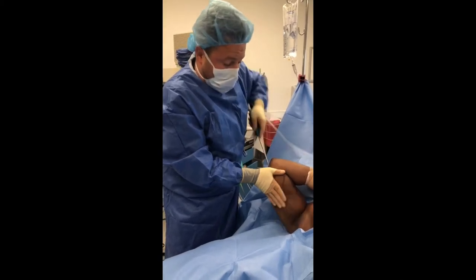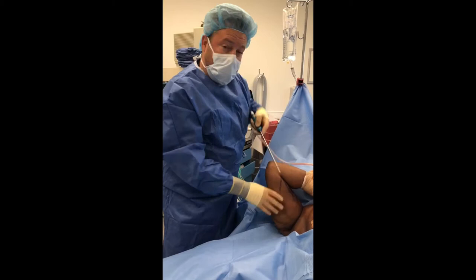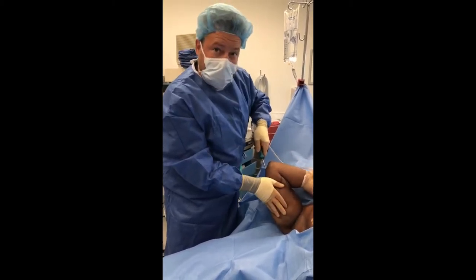All right, welcome back. Board-certified plastic surgeon Dr. Jason Petrangero. I'm doing an arm lift today for all of your requests, so follow along with me and we'll start explaining the first steps here in a second.